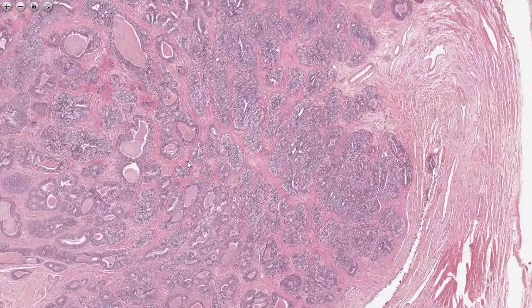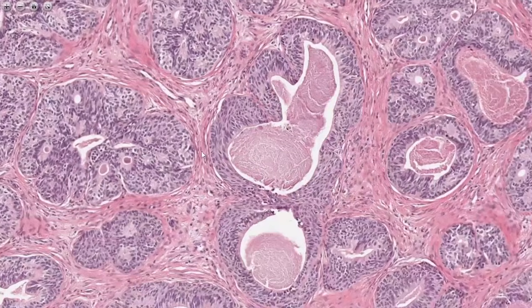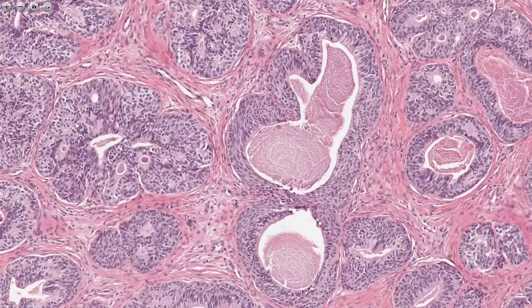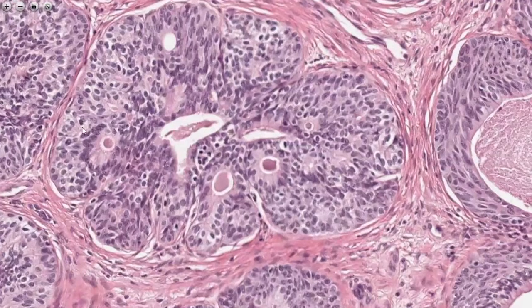Now you look at the cells. These cells are dual. There is a dual population of cells, and there is proliferation of basal cells. These are all basal cells. These lining cells are acinar cells, and this is a very good slide. Proliferation of basal cells can be appreciated here. These are all proliferating basal cells.